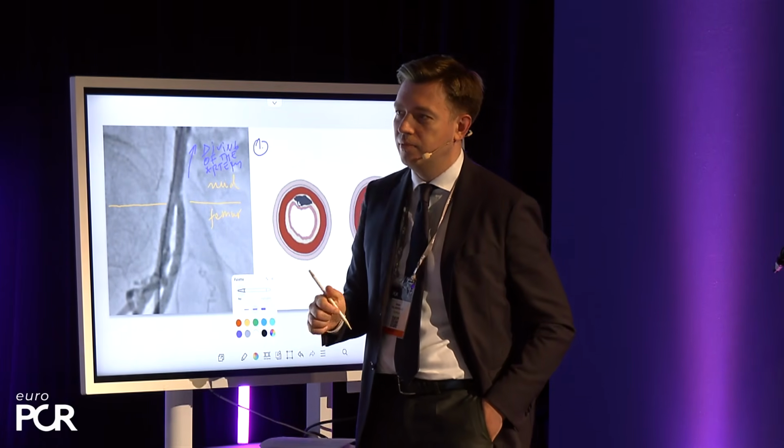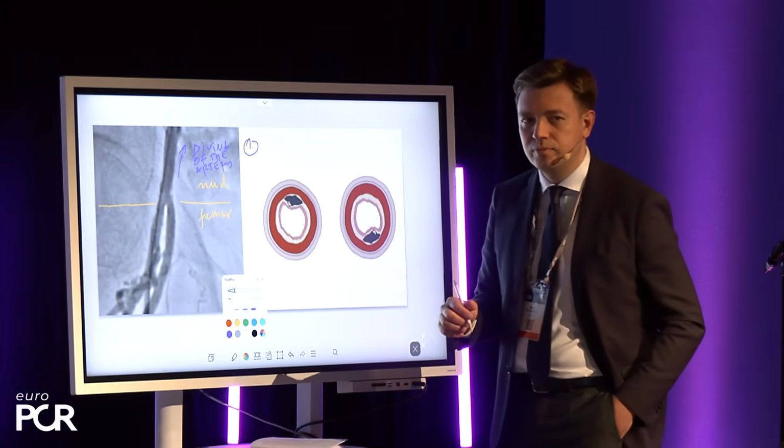Because then you have much more failure of your suture-based vascular closure device, because you cannot get the anchor nicely pulled back against the wall of the artery. That's the real issue, and I think it's probably the most frequent cause of failure of a suture-based closure device. Yes. Okay. Wolfram? Tilly, some question from the audience.